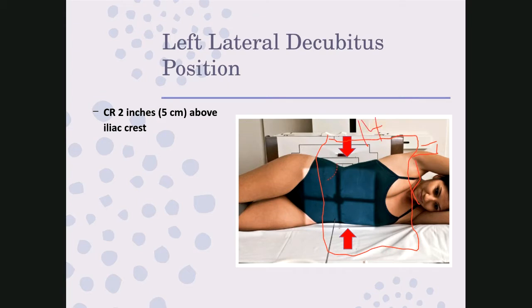And we know that on the left lateral decubitus, on the erect abdomen, and on the lateral abdomen, we have to include diaphragm. So typically what you would do if your patient did not fit on one IR, you would start with the top picture first.